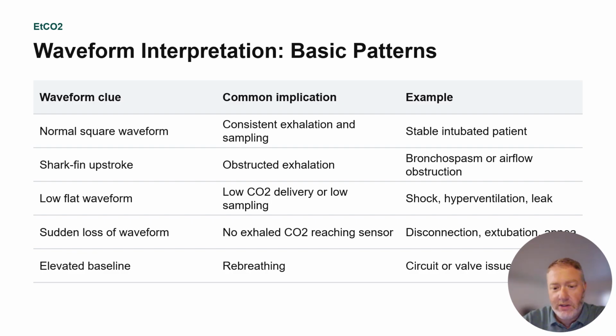Typically, that's a circuit or a valve, or again, if they're on a non-rebreather or even a bag valve mask. If there's not enough flow going to the device to inflate the bag and keep it inflated, then they're at risk of rebreathing CO2. And if there's an end tidal hooked up to it, you'll see that baseline elevate a little bit as the CO2 rises.